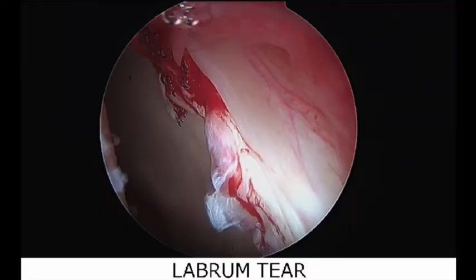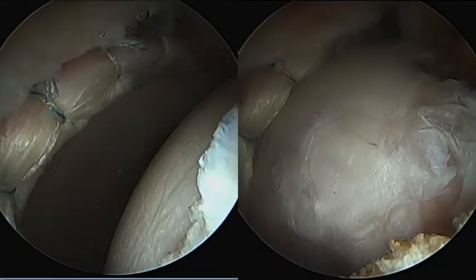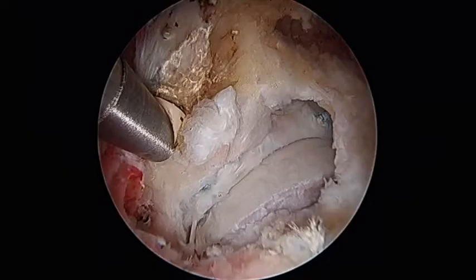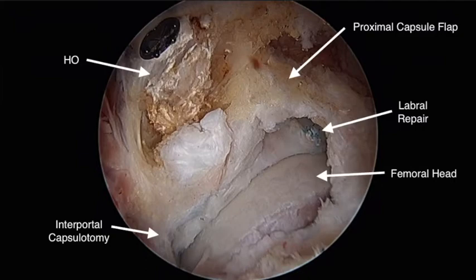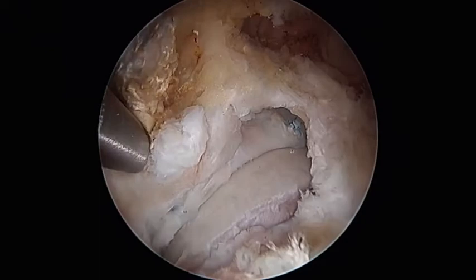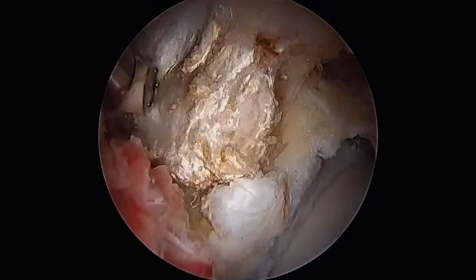Oftentimes the HO does not restrict access to the central compartment, so labral repair and addressing intraarticular pathology is possible, as would be done with a standard hip arthroscopy. Once central compartment work is complete, the hip is taken out of traction, and the RF device is used to carefully dissect the HO free from surrounding tissue. The radiofrequency ablation device is directed toward the HO fragment to minimize the amount of surrounding tissue removed.